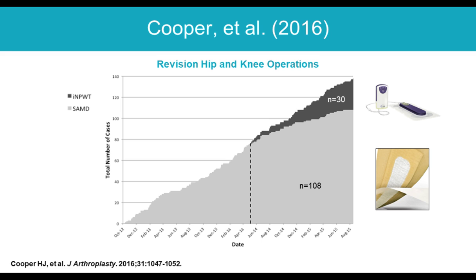treating a periprosthetic fracture. This study compared my historical experience using these antimicrobial hydrofiber dressings that I talked about as our standard of care, and they compared that to the incisional negative pressure dressings that I began using in 2014. And one interesting point that is important to make is that when I started using these in 2014, as you can see, I was still using a lot of my standard of care dressings. And I was really not sure which patients would benefit from the negative pressure dressings.